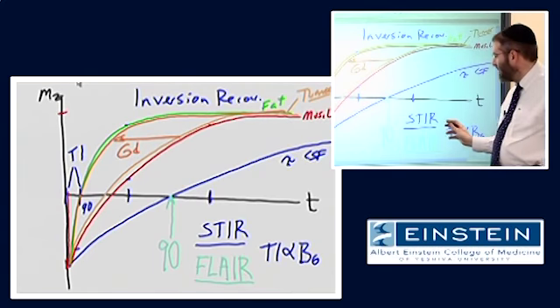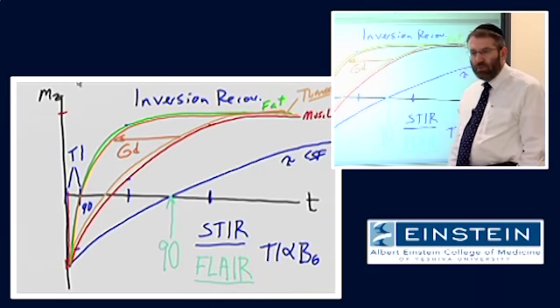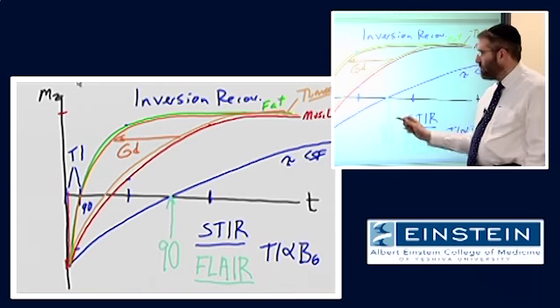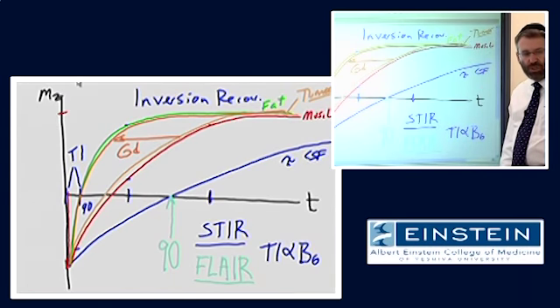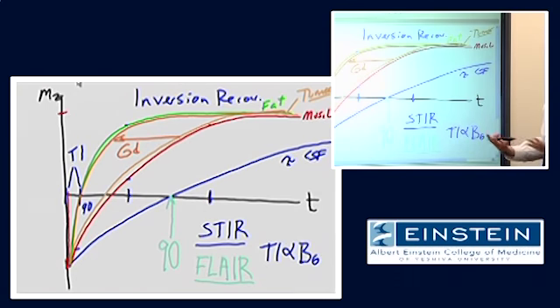So this is generally not an advisable way to do fat suppression if you're going to be using a contrast agent. Now that's a little bit of a problem, because one of the main roles of fat-suppressed imaging, as the people who do clinical imaging know, is to be able to see contrast enhancement in areas where we have lots of fat. The fat has very high signal on a T1 weighted image. The contrast-enhancing abnormal tissue has high signal on a T1 weighted image. If they're both embedded in each other, it's hard to tell them apart.